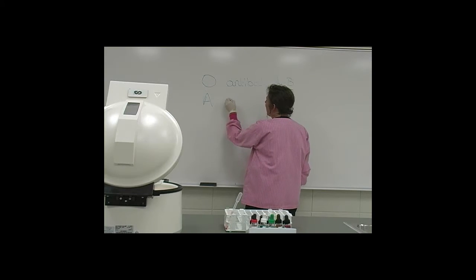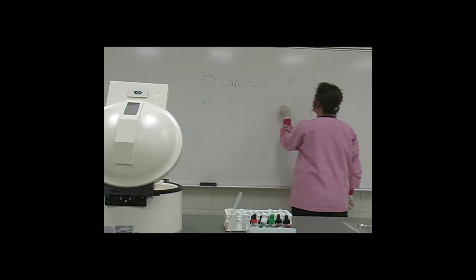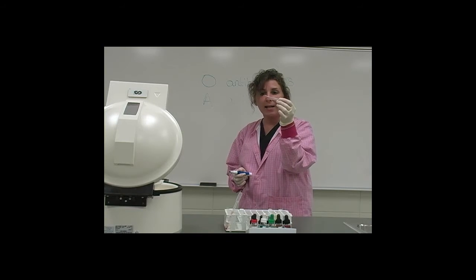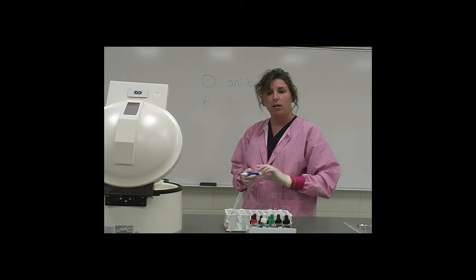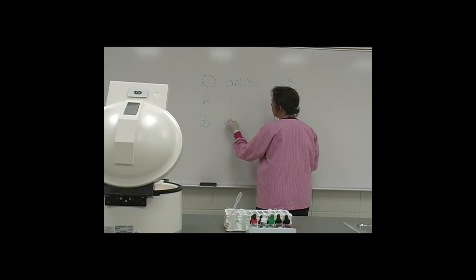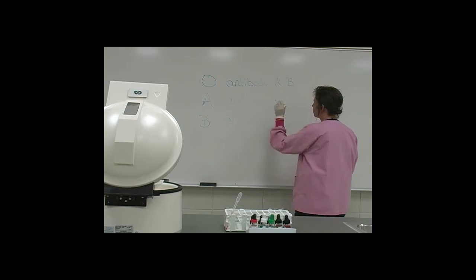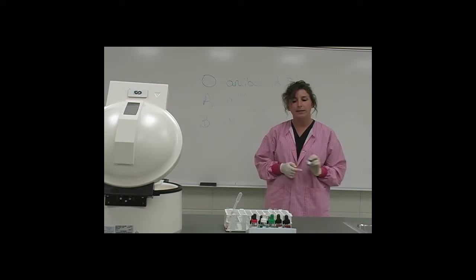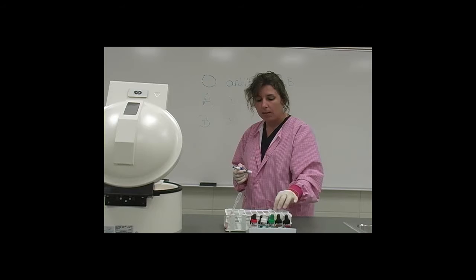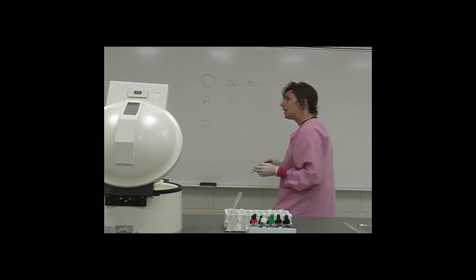In the A, we have antibody B. And therefore, we would not have had a reaction in our B tube as you saw in the test tube that we performed. In the B, we have antibody A. And the antibody A is actually going to be a negative reaction in the A tube, but a positive in the B tube to depict that the patient is actually B.